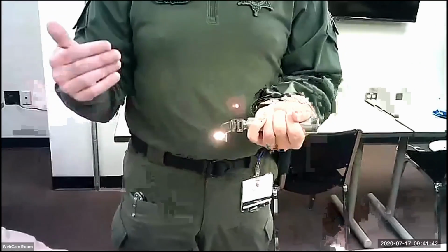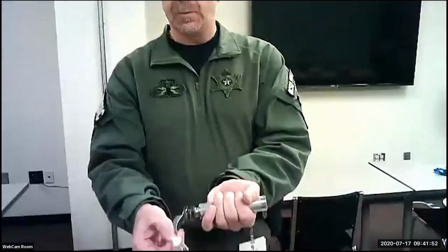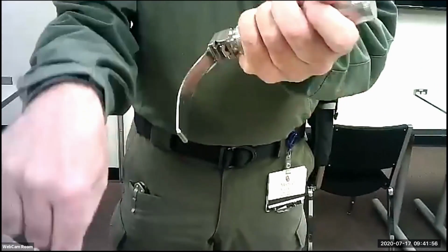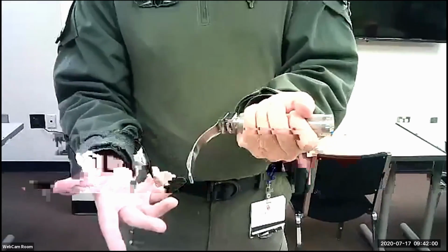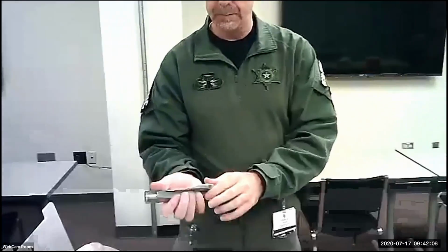Aviation and medicine have all been learned by blood, which means we've made mistakes. We've learned from them, we've moved on. Aviation, same thing. Oh, that didn't work, they crashed and died. Let's fix this. Same thing with this bulb. Someone along the lines, this was loose, they went to intubate, and the bulb fell off inside the mouth and went down into the lungs. So we change our practice. Evidence-based medicine, we make sure these are tight, make sure the light's good, it doesn't turn on and off.